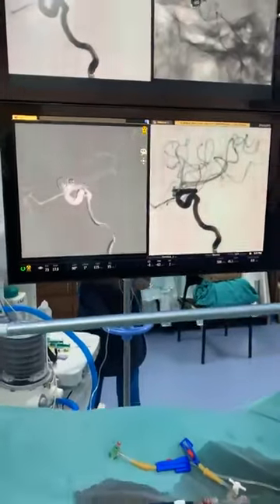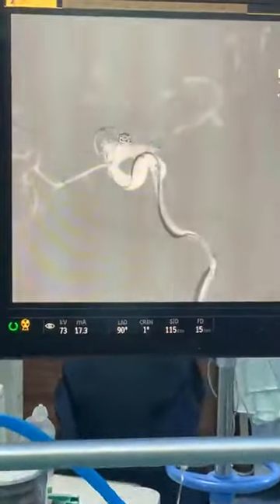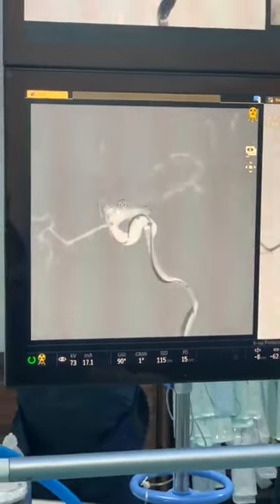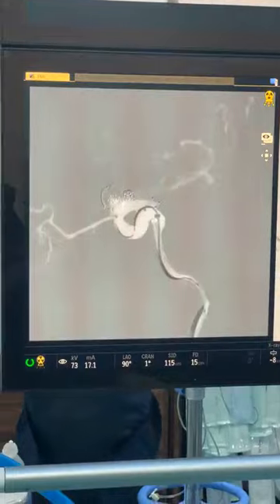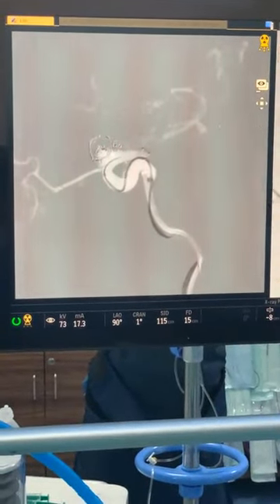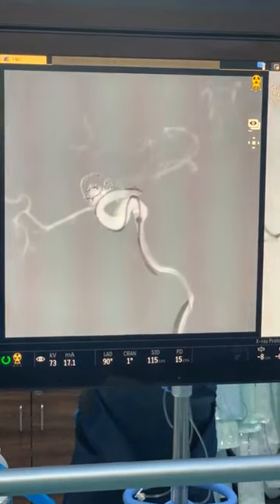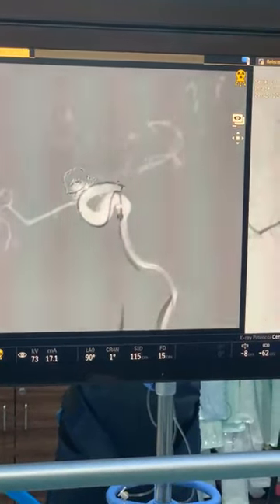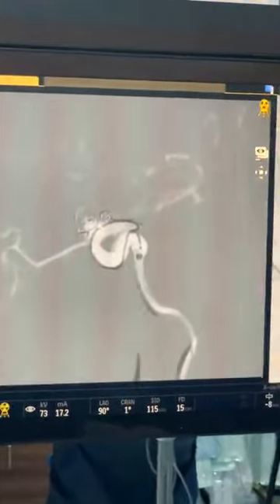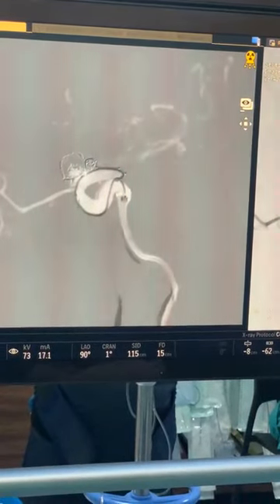It's very important to have this. So pretty good. So this is where we will start deploying. This will be a good position for us to start. In the micro, hold the ball just to release the wire.